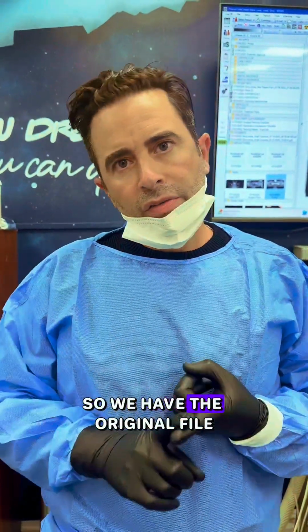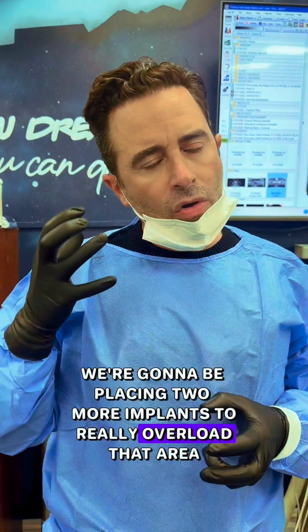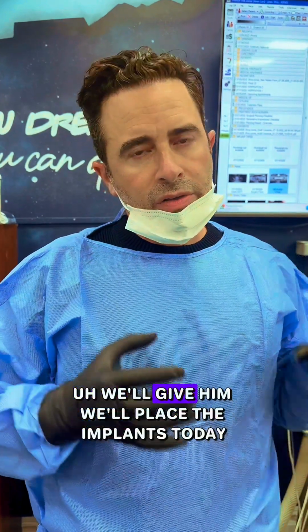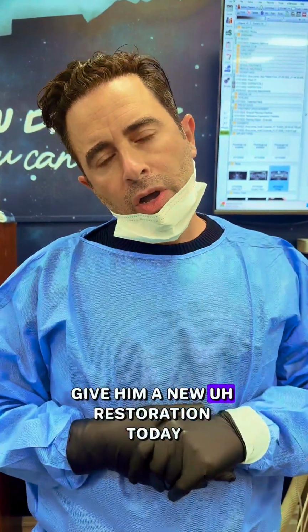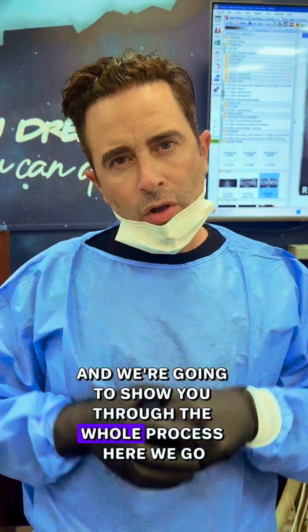So we have the original file. We're going to be placing 2 more implants to really overload that area with as much support as possible. We'll place the implants today, give him a new restoration today, and we're going to show you through the whole process. Here we go.